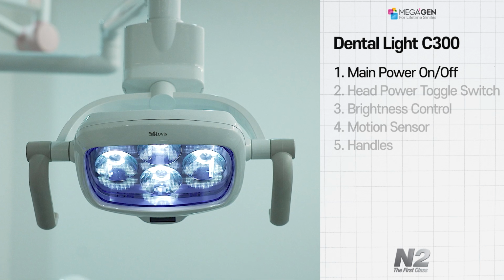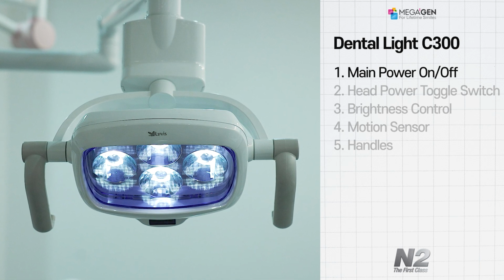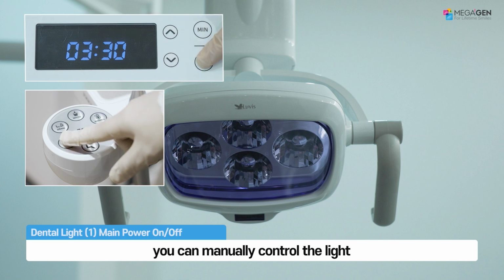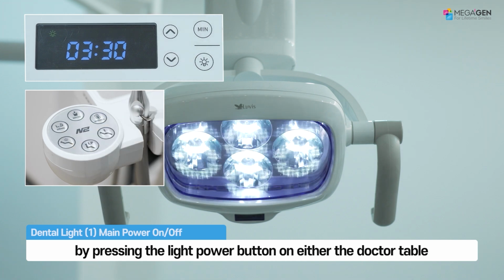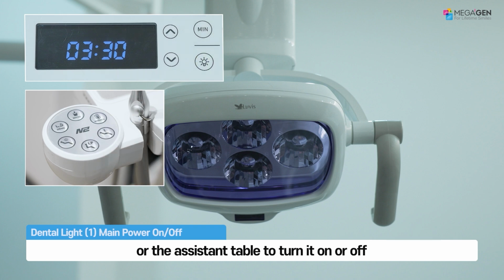How to use the dental light C300. To operate the light's main power from the chair, you can manually control the light by pressing the light power button on either the doctor table or the assistant table to turn it on or off.